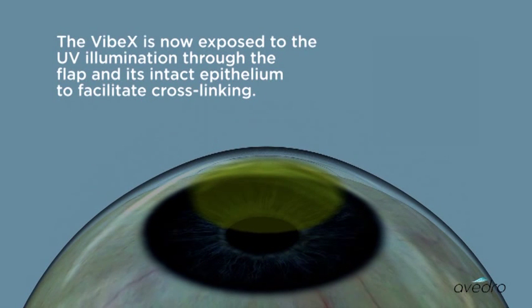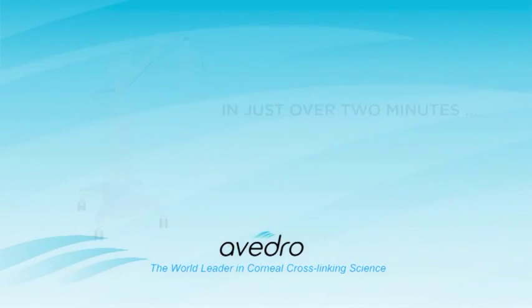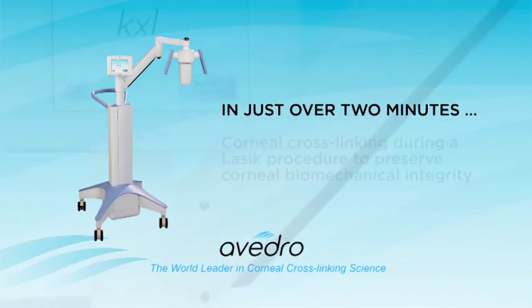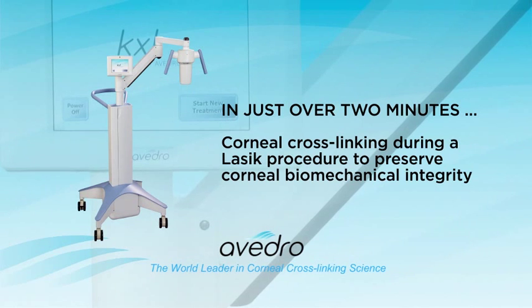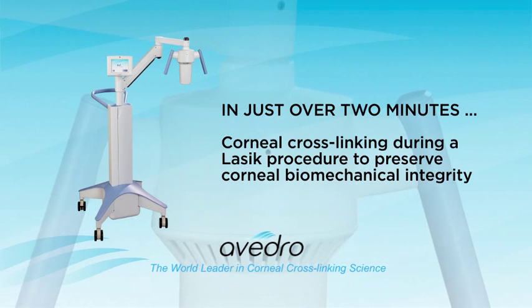The Vibex is now exposed to UV illumination through the flap and its intact epithelium to facilitate cross-linking. In just over 2 minutes, corneal cross-linking during a LASIK procedure preserves corneal biomechanical integrity.